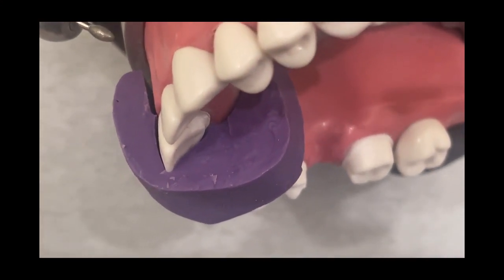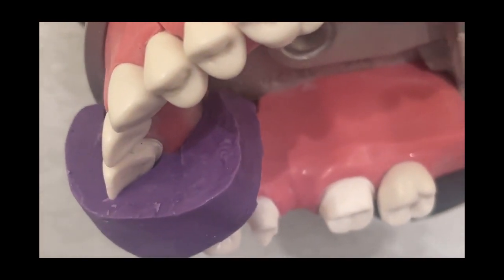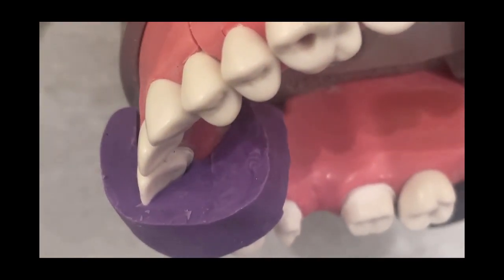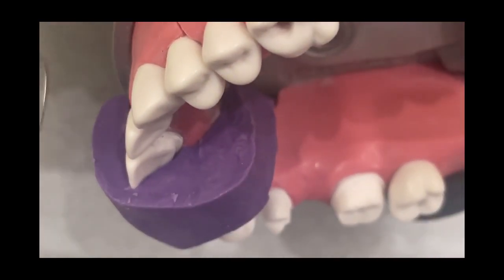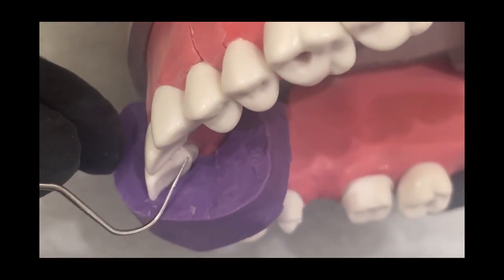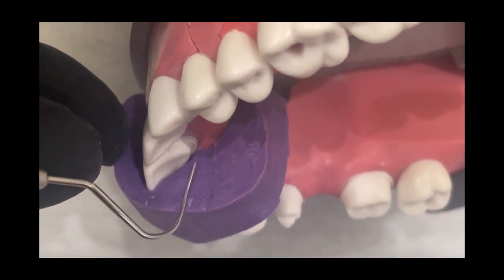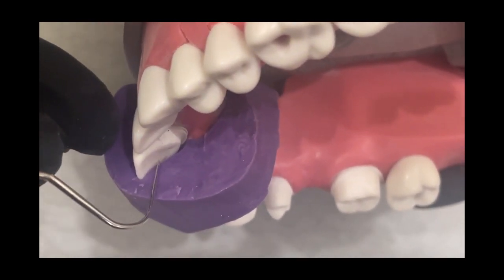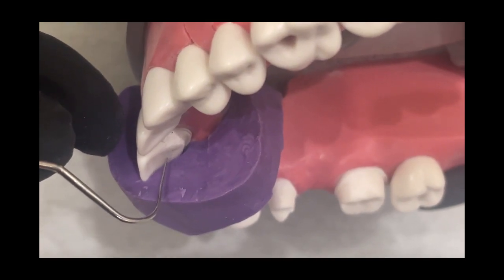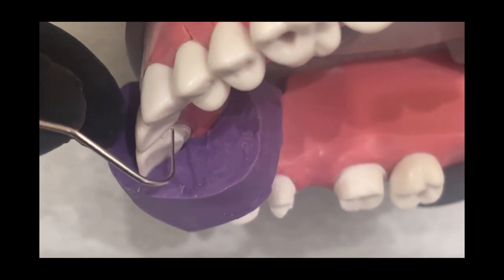I'm just going to pop this in real quick to show you what has happened so far. We've basically just removed this bottom part, but the shape of it is different than what the tooth was before — there's a wall and then it connects. Now I'm going to work on this part to show you how to shape the cingulum without losing the wall that we just made.